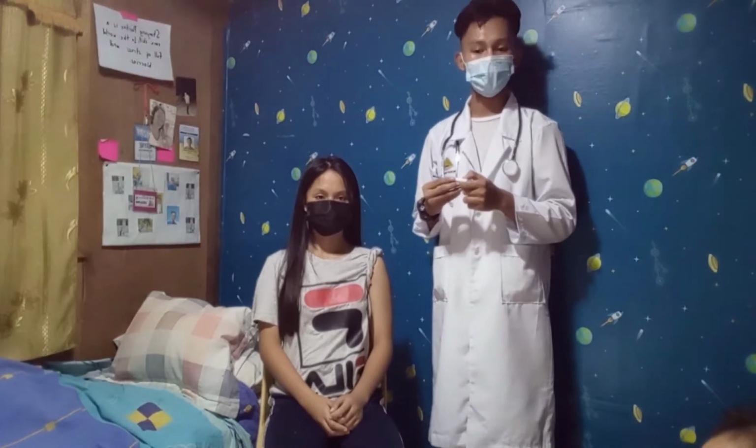Note the result of the temperature. Remain holding the thermometer in place if the client is irrational or very young. Documentation provides ongoing data collection. And that's all.